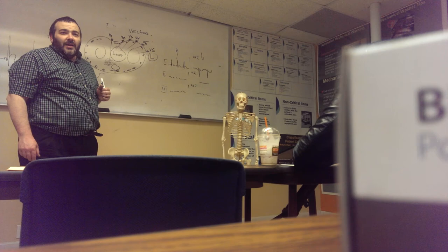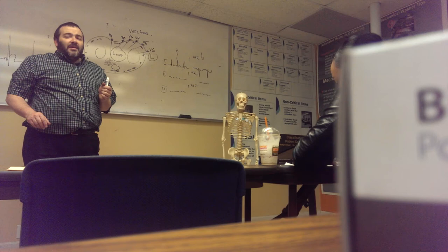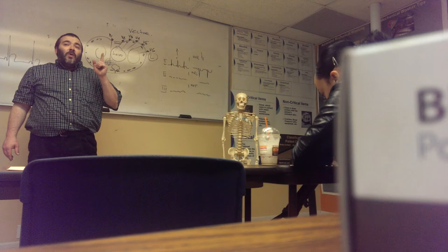Okay. Here are a few other things that we must know. Ready? Where should standard lead one always point? Up. AVR should always point? Down. And if they're reversed, what happened? That's not an answer. Wait a minute. Lead one must always point up. AVR must always point down. If they are reversed, what did you do wrong? You misplaced the wires from the left side to the right side and vice versa.